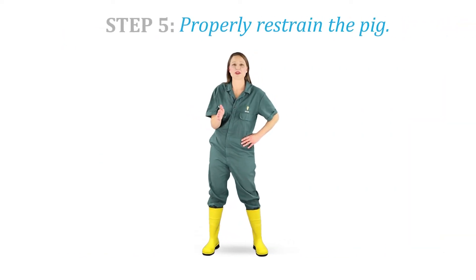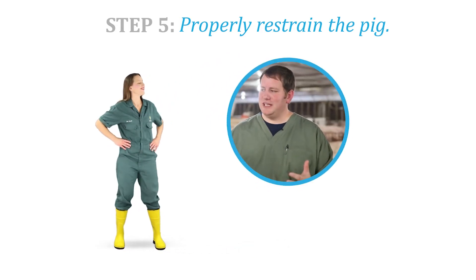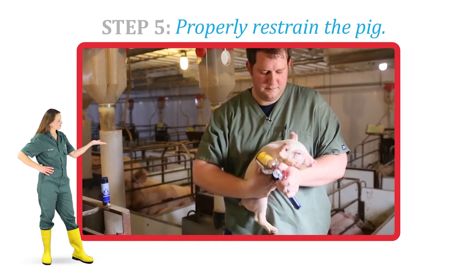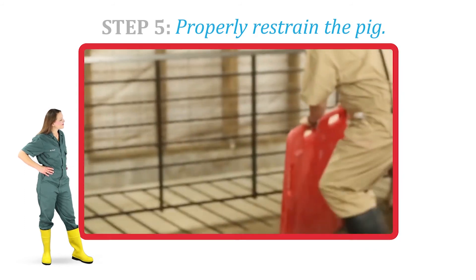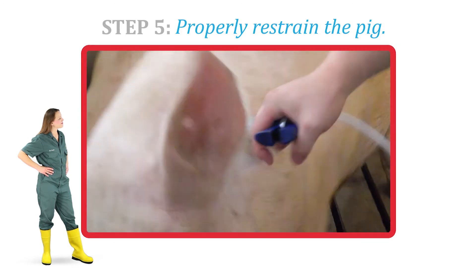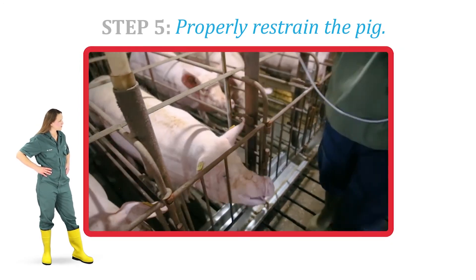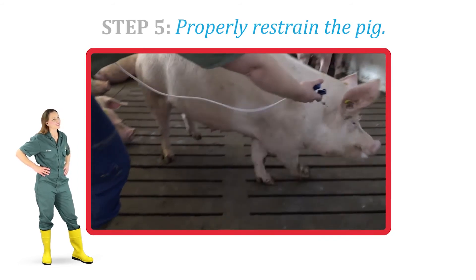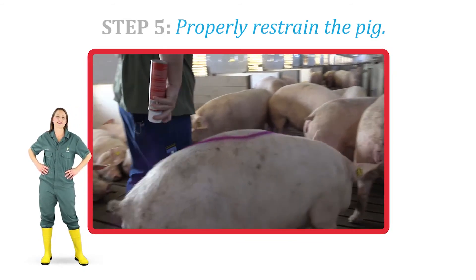Step 5. Step 6. For different sized pigs we need to restrain them differently. For our smallest animals — weaned pigs and younger — we can pick them up and inject them easily. For older grower-finisher pigs, using a sort board and crowding them is the best way to inject. For our largest animals like sows and boars, we may use a stall or approach them gently in a pen. We always want to make sure we're marking them so we know which animals were treated or vaccinated.